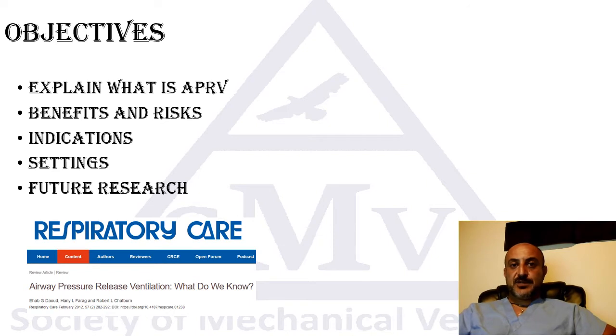To be honest, not a single mode that I know has been more controversial than APRV, despite being very beneficial. There are multiple reasons for this. Some include the problems with its name. There are so many names in different ventilators for the same mode, and a lot of research using the so-called APRV but with really different settings.